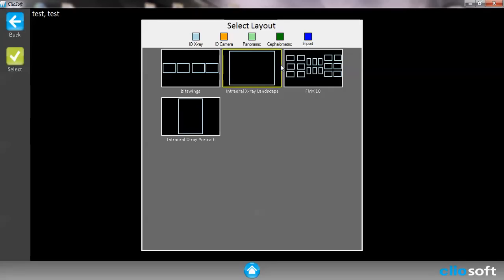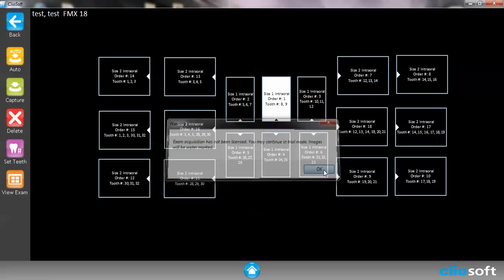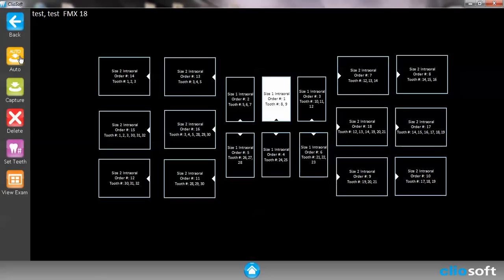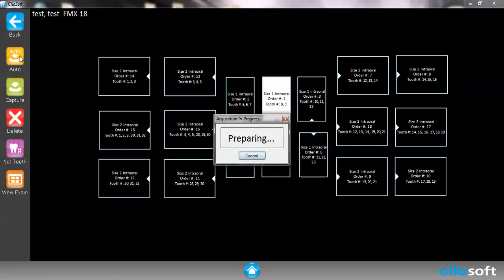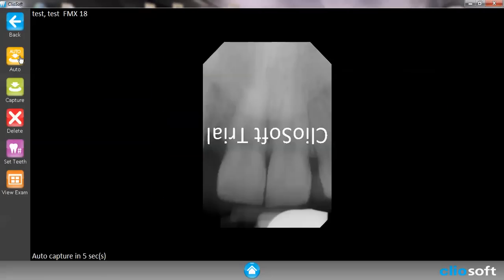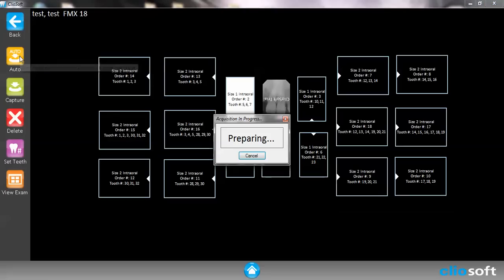Again let's go ahead and hit auto. If I hit auto it will automatically move to the different placeholders once the imaging is done taking.